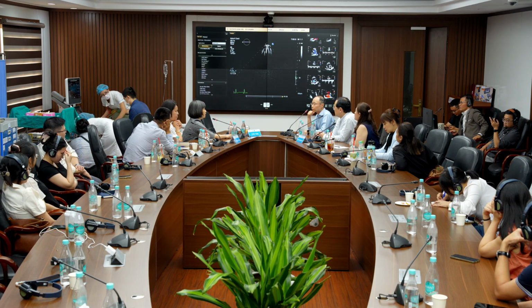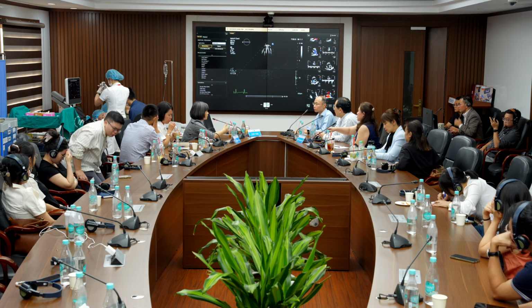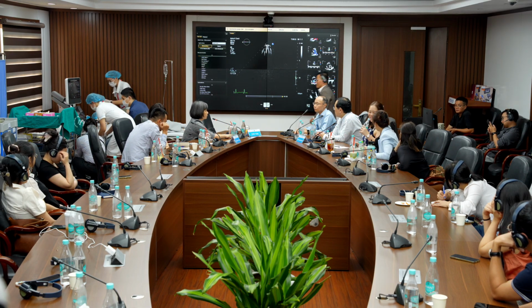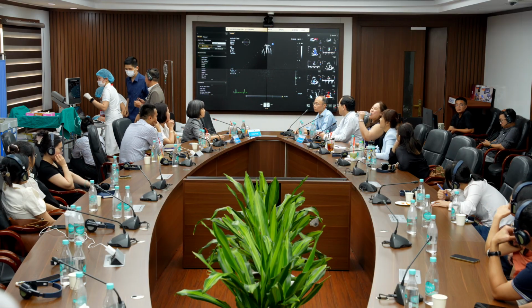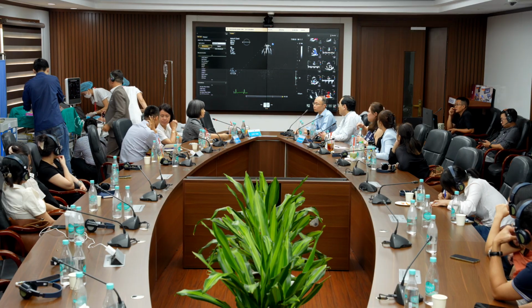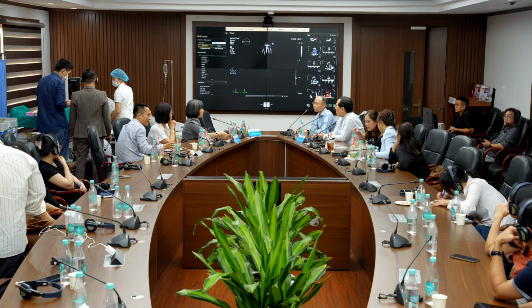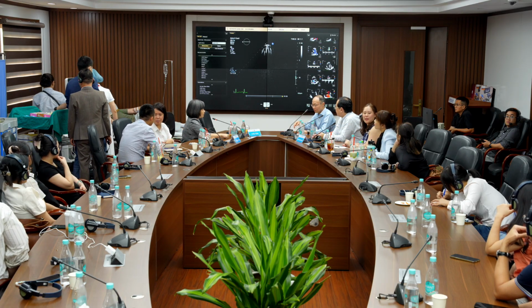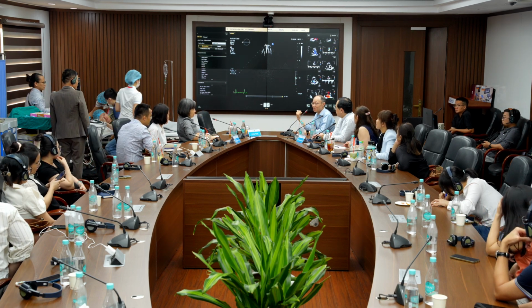We will do the TOE, and you can guide us to make the 3D of the tricuspid valve in this case. And for the concern about the cath and the MRI, we will explain to the family, and maybe we will do them in the next few days to find out the cause of tricuspid regurgitation in this man. But can I have your thoughts about what's going on here?